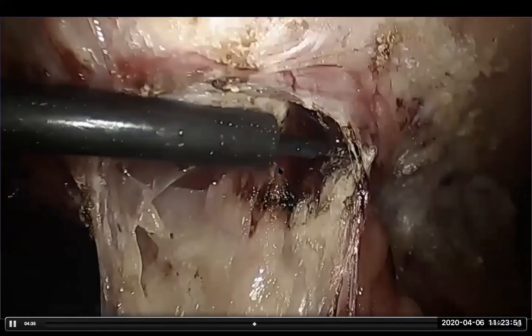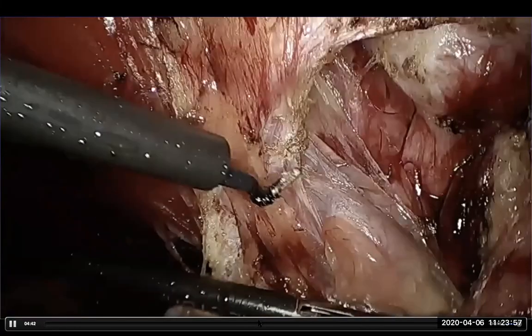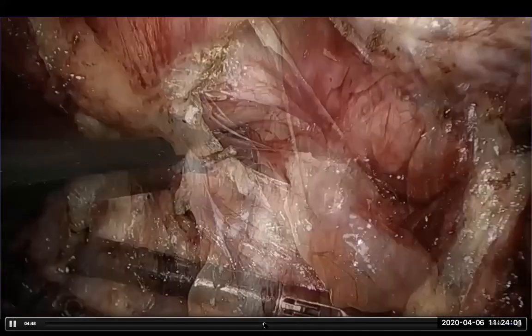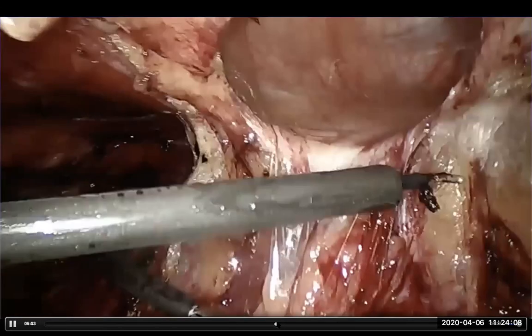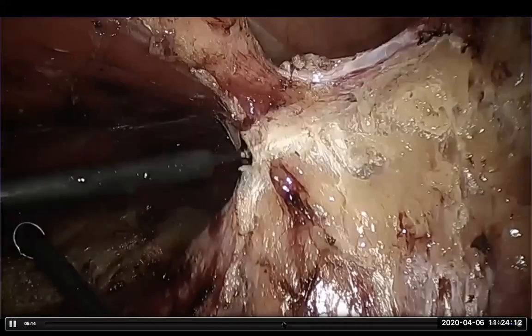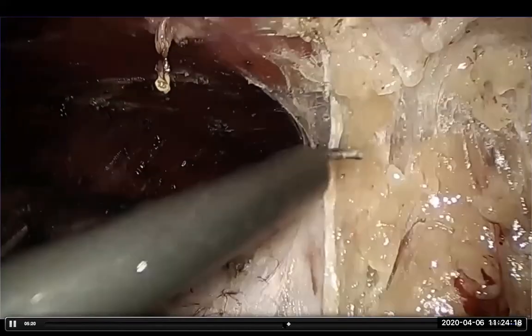All right. So now I will fast forward this part. You're seeing that we are taking out the entire sac. Okay. So here we are not opening the peritoneal cavity at all. We are successfully taking down the entire sac. Now, when taking the entire sac down, please remember that your linea alba has to be at the ceiling. You must stay under the linea alba.